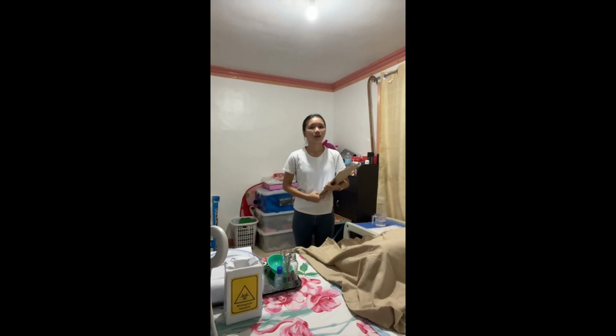Female urinary catheterization. Hi, good morning. My name is Caster Kaimer from BSN 12F, and today I will be performing female urinary catheterization. Catheterization is the insertion of a catheter in a patient's bladder.